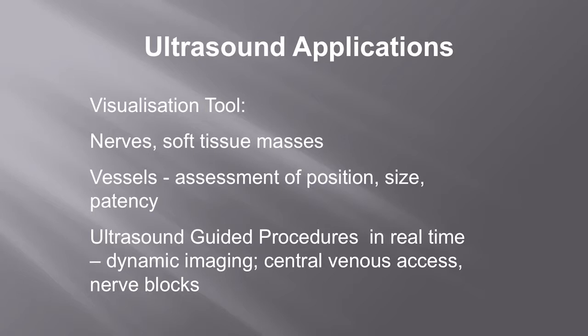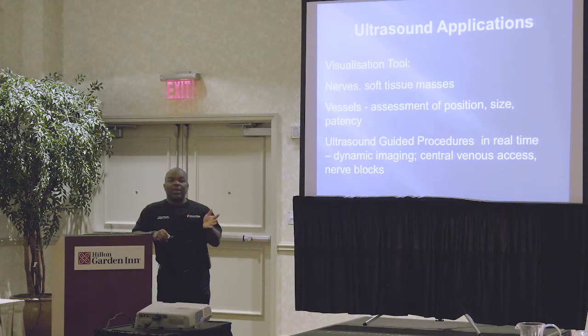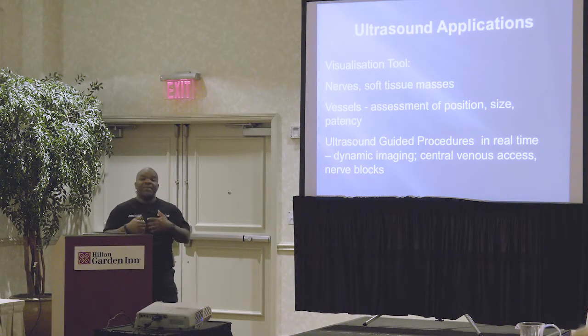If you're gonna put in a central line, you must use ultrasound, all right? It is a CMS requirement to use ultrasound guidance. You can't do blind sticks anymore. So if you wanna play cowboy, and you said, oh, I can actually see the jugular from here, I'm not using ultrasound, that's fine. All right, but just know you're violating CMS protocol. So what happens now when you dilate the carotid because you didn't use ultrasound? Well, you're gonna actually get yourself in some trouble, right? Because you can't defend yourself.